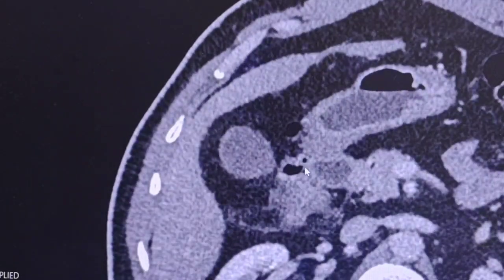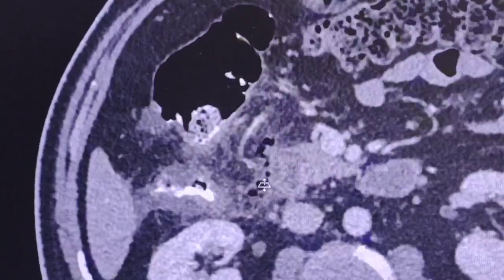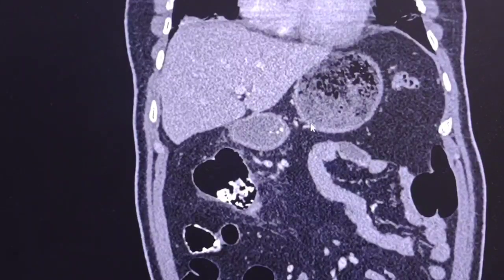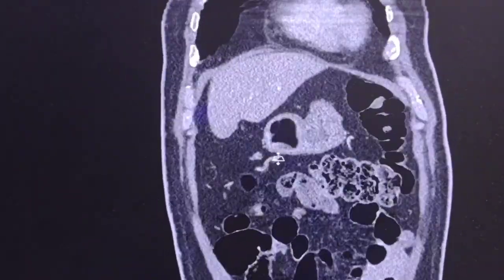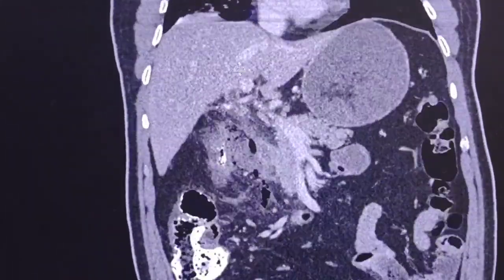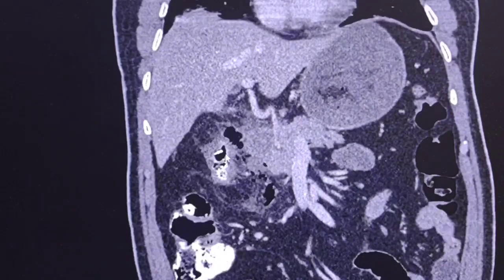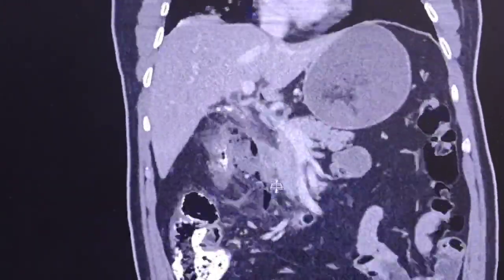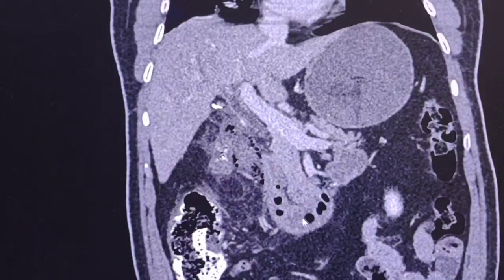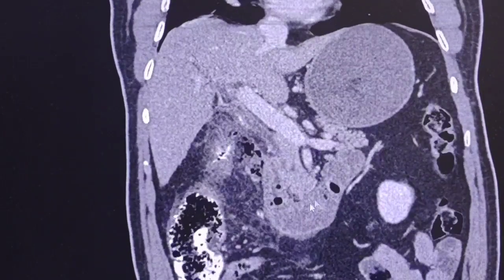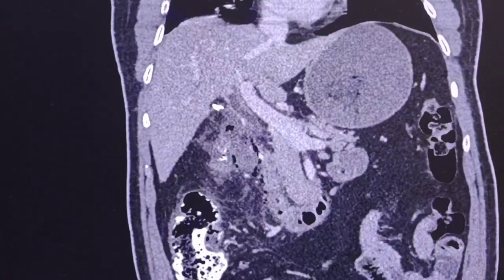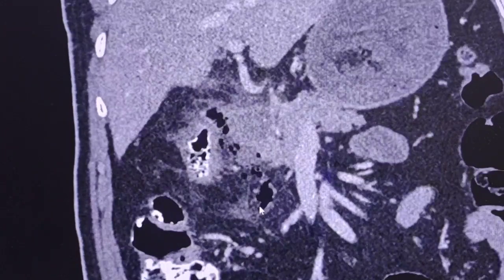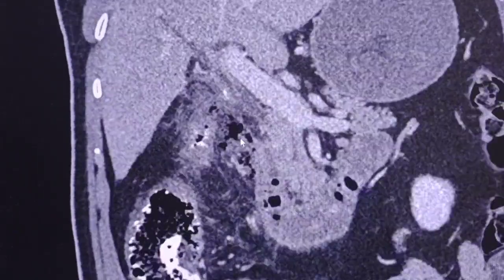Now let's go back to our case. Here is the perforated duodenum in coronal views. Here is the stomach, which is moderately dilated, and here is the pyloric antrum and duodenum. Here is the third part of the duodenum, and the second part of the duodenum with the extraluminal gas — here and there, in multiple areas.